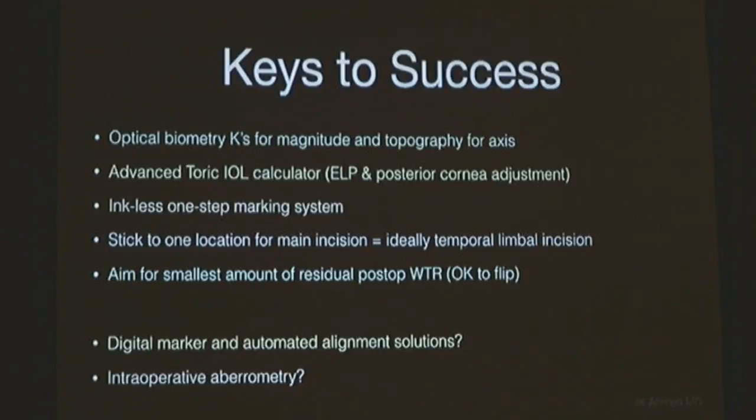So we've covered a lot of different things about astigmatism. It's something I think that is fairly easy to treat, but does require a fair amount of thought. And we've got great technology preoperatively. We've got great marking systems. We have intraoperative guidance if we decide to use that. And of course, we have other options to treat these patients if they have residual cylinder afterwards as well.